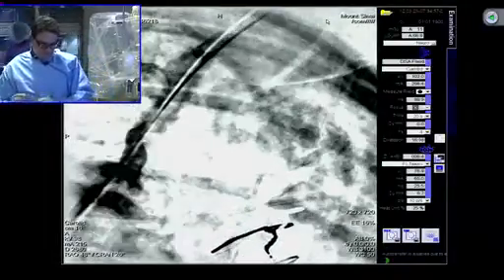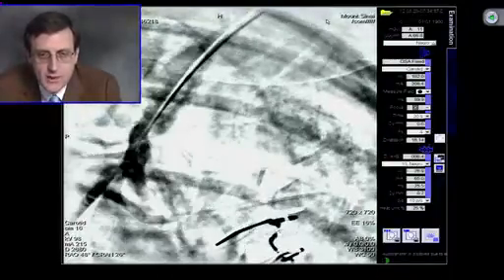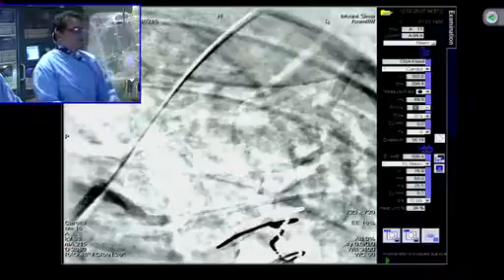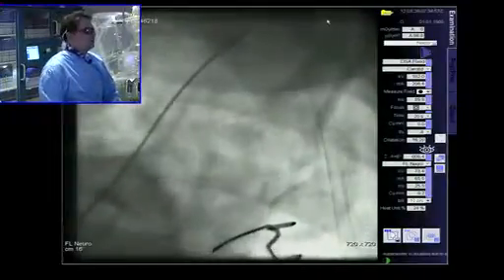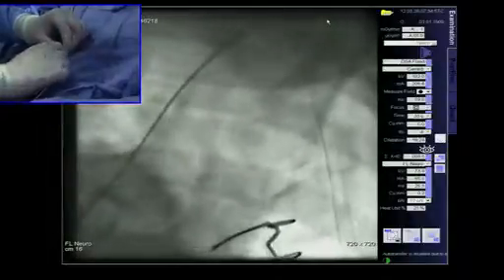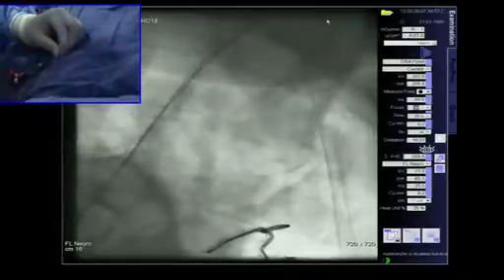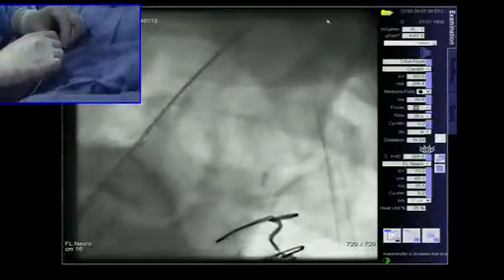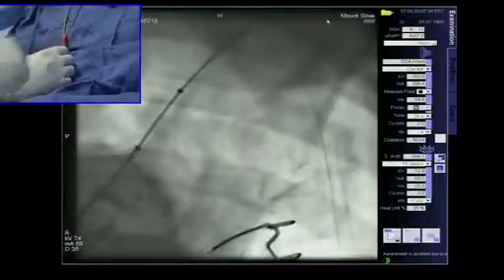The vertebra seems a little pinched here, but I must say that we have a suboptimal picture because of the breathing. But this is another consideration as we do these balloon inflations. And obviously, you definitely do want the ability to land it perfectly. You want to be able to avoid that vert. I mean, you are going to get a little bit of overlap, as you know very well. There's no question that went much easier.